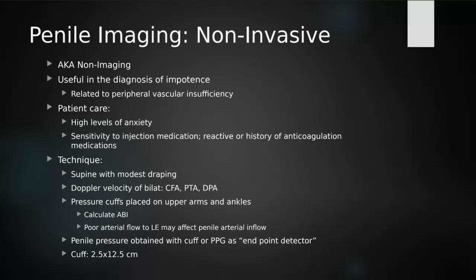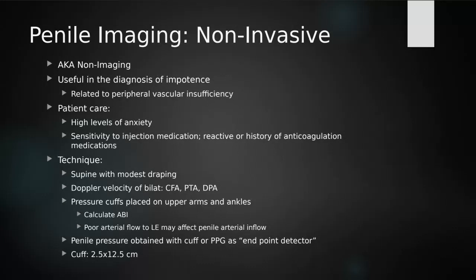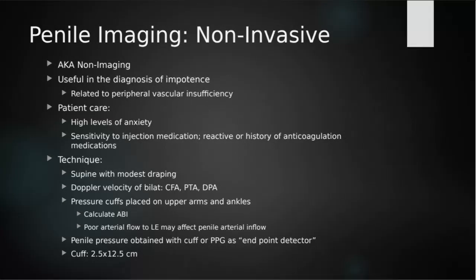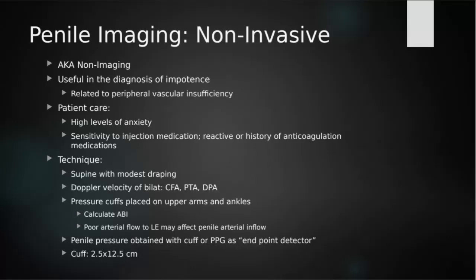With these exams, whether it be non-invasive or invasive, penile imaging is going to bring an extremely high level of anxiety. High level of anxiety for you. High level of anxiety for the physician who has to inject the patient's penile tissue with medication, and extremely high level of anxiety for the patient himself. So this is something that we are keeping staff to an absolute minimum. It is also something that you need to be comfortable with. And if at any moment you feel like you are not comfortable, or you feel like you are in a vulnerable situation with the patient, you need to leave immediately. But it's something that we need to make sure that we are communicating effectively and we are putting the patient at ease.